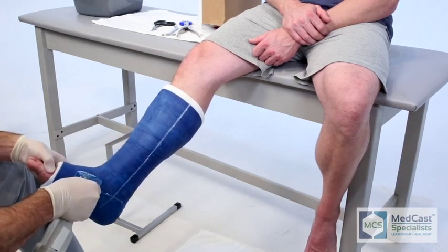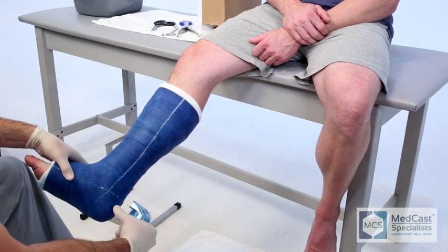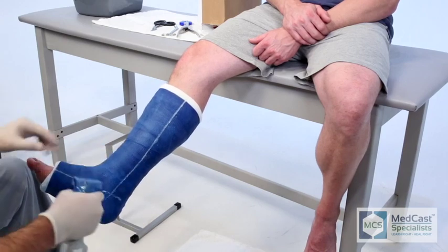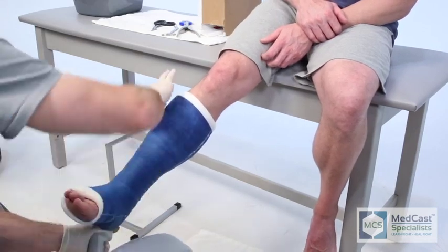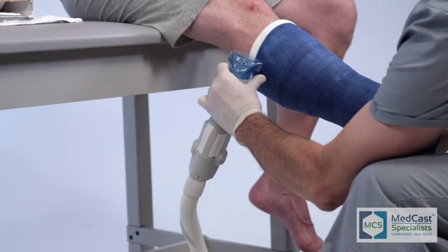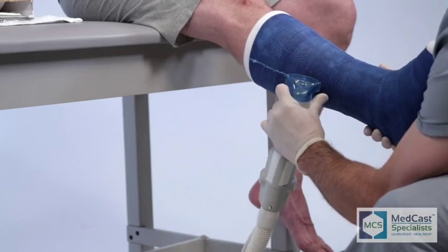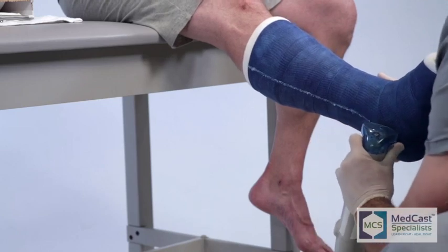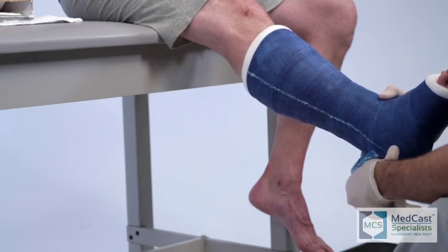It's a very good practice to avoid prominent areas like behind the medial malleolus when you're using the cast saw. We haven't talked much about the cast saw, but it's always a good thing that when you sit down prior to removing a cast or at the start of the day, just check your blade and make sure that it has enough teeth to actually work. Nothing is more frustrating than having a dull cast blade — you run the risk of heating the blade up and burning the patient with a very dull, non-compliant cast blade.